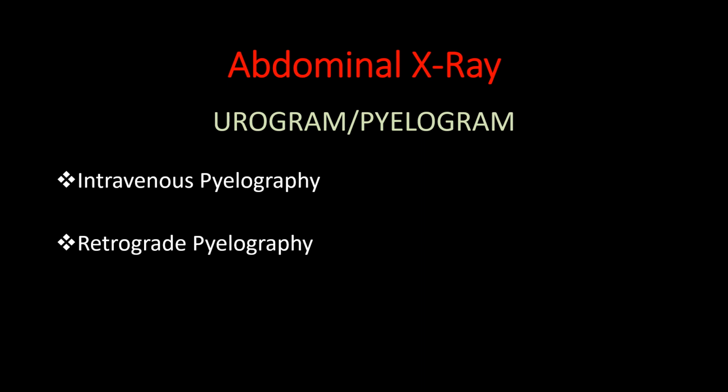Today we will discuss urogram and pylogram. Pylography is a radiological method by which the urinary tract is visualized. The radiograph thus obtained is called pylogram. It can be done in two ways depending on the route of administration of the radiopaque dye.